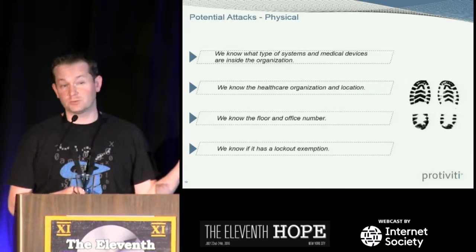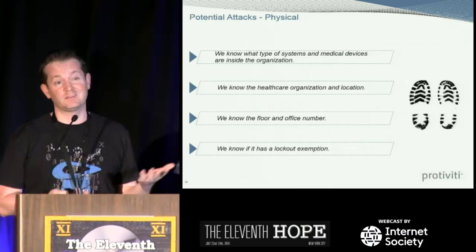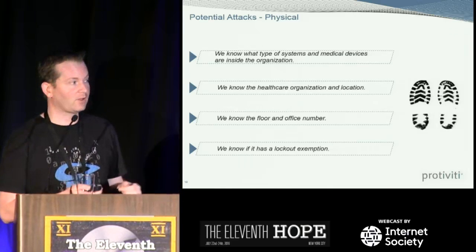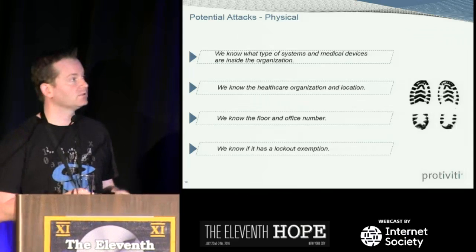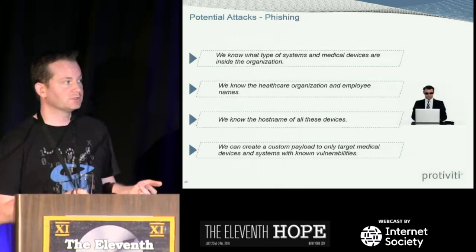And you also know which ones have lockout exemptions, right? So if you're going to plug something in and run it, it'd be pretty nice if you didn't have to worry about a lockout coming on and having to have a password be entered. So it certainly makes a physical attack easier to conduct by having this type of information.